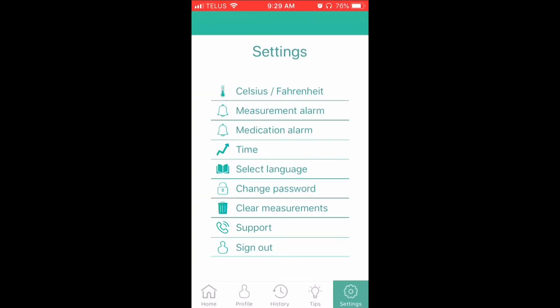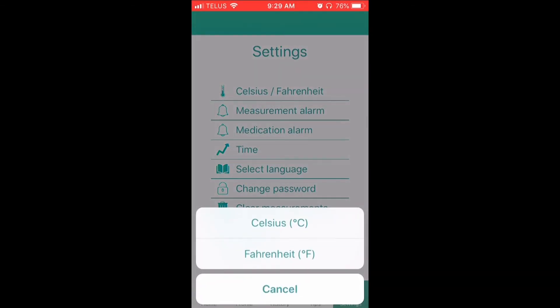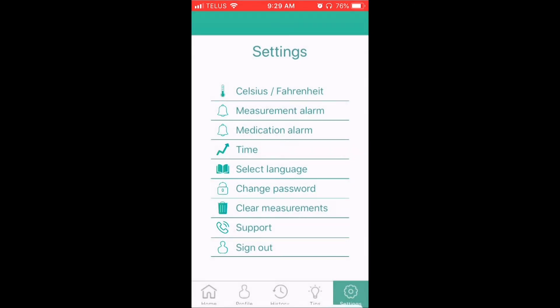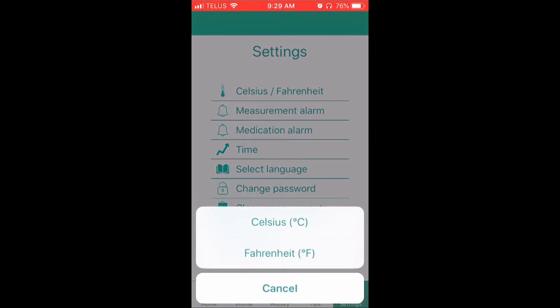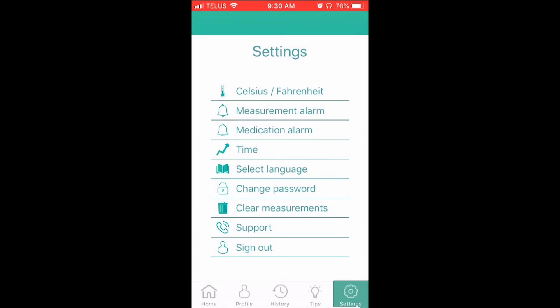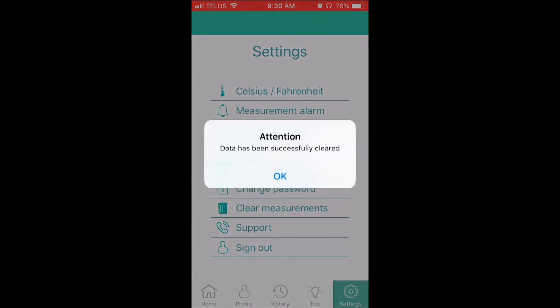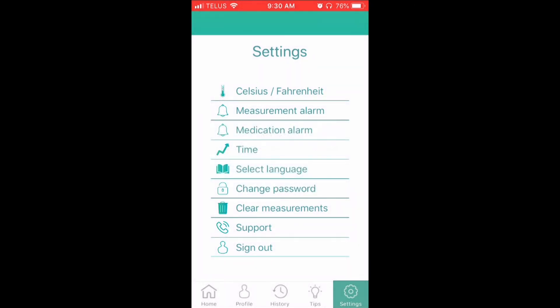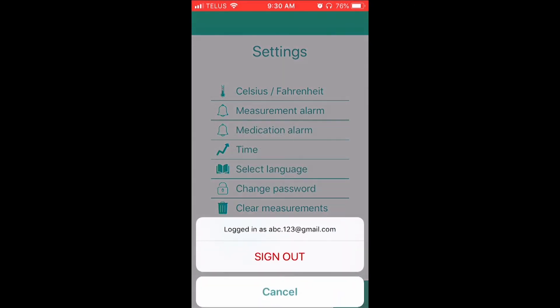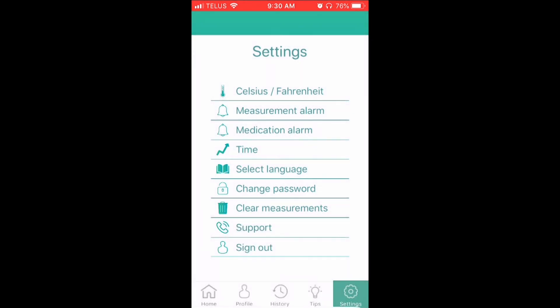In the settings section of the app, you can make personal changes to the app, including language preference — English or French — changing your password, setting your preference for the temperature readings in Celsius or Fahrenheit, and signing out. At any time, you can also contact us for any support and troubleshooting if needed. This concludes our video tutorial on how to use the BIOS Precision Temp app. Thank you.